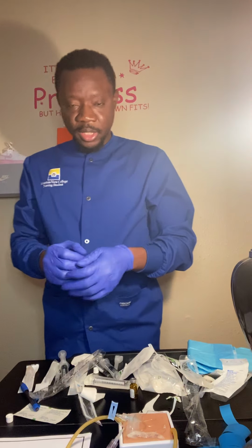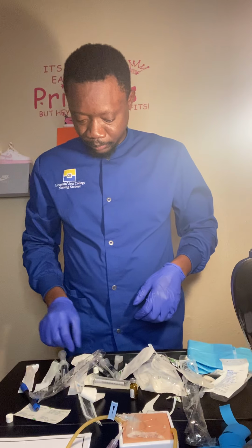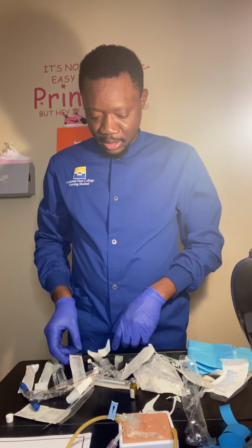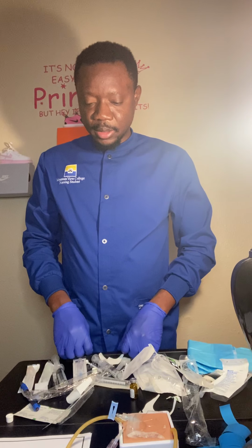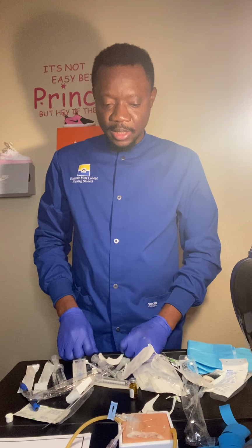So once I'm done with clearing my table, putting my patient in a comfortable position, lowering the bed down, then it's now time for my documentation. So go ahead and remove my gloves before hygiene, and I will document that IV started in left arm with 22 gauge catheter and 1 stick and 50 mg meperidine administered.